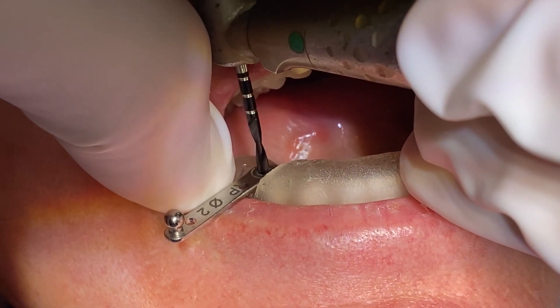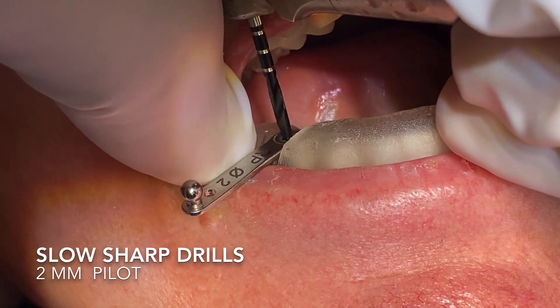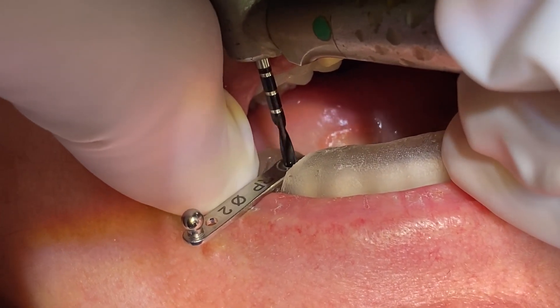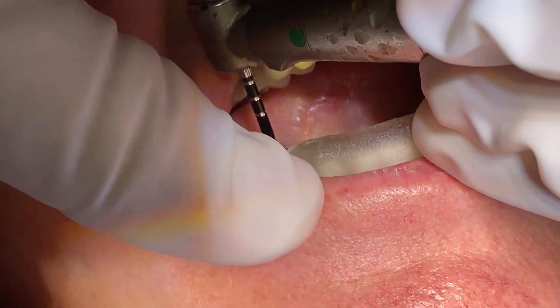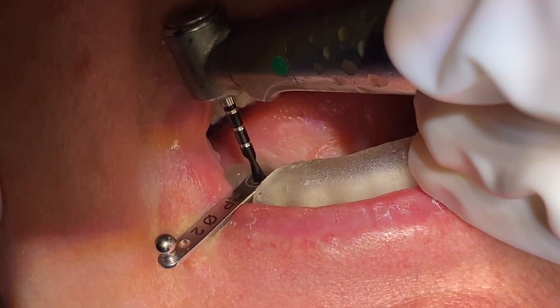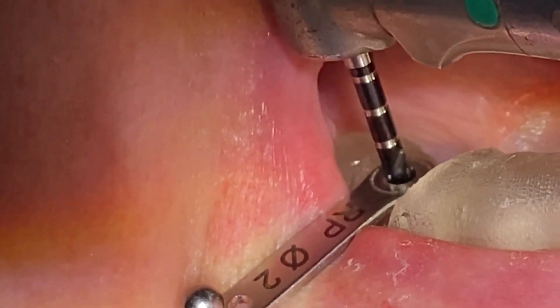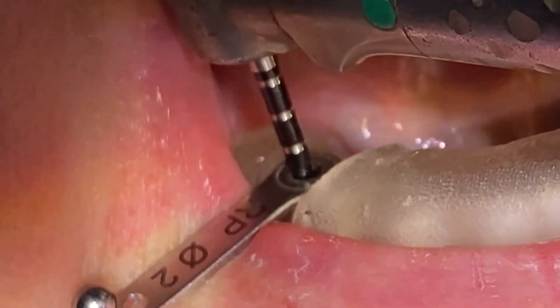I start with a 2mm twist drill without doing any flap whatsoever. I use a template that I fabricated in DTX Implant Studio. I'm going through with my 2mm twist drill very slow, so I don't have to use water if I have a very sharp drill — a brand new drill. I'm going at about 50 RPM, so not very much at all. I can take it out and feel the drill; there's no heat at all, so it's very, very low heat. I'm taking my time and going in and prepping the osteotomy.